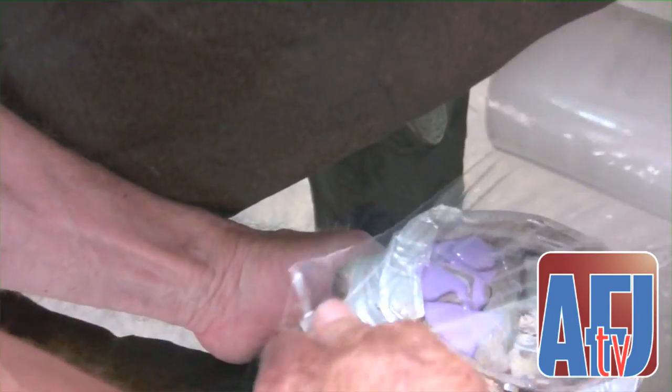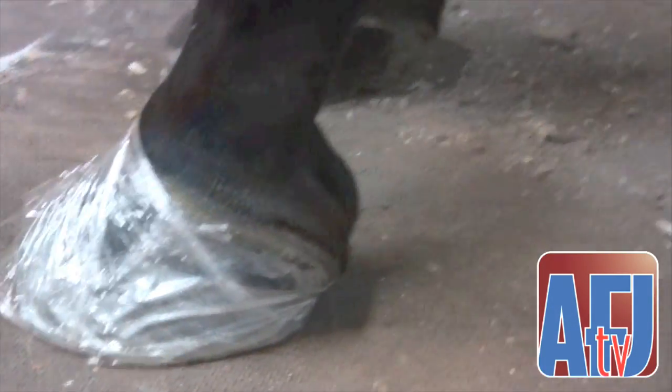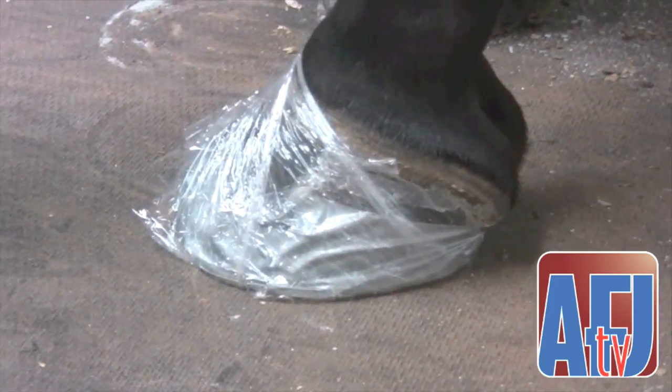When I go back, I want to see that heel supported well without any bruising in the bars or on the frog. From my experience using this product, I expect to see the horse well supported, those walls beginning to grow back together, the foot beginning to reaffirm itself without the separations, and no bruising in the area where we applied the silicone.